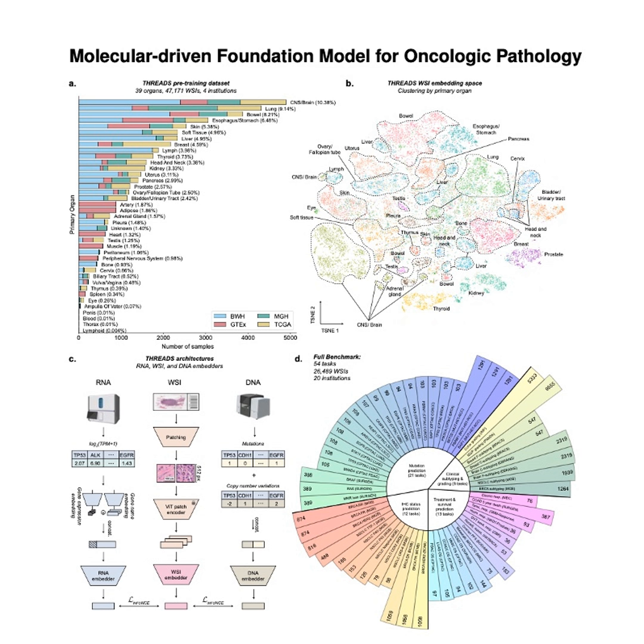Okay, 6.3% average gain is impressive. But I need to clarify something important for listeners. Did they have to take Threads and then spend ages fine-tuning it heavily for each specific task out of those 54? Or did it perform well more easily? That's a great question, and it really highlights the power of the foundation model approach. Now, the superior performance they reported was achieved using just simple linear probing. Linear probing, what does that mean practically?